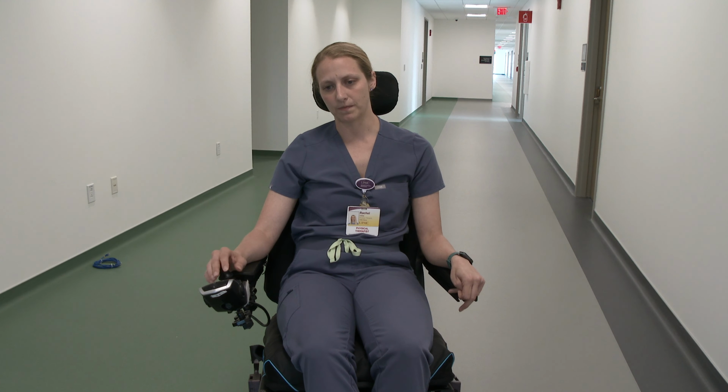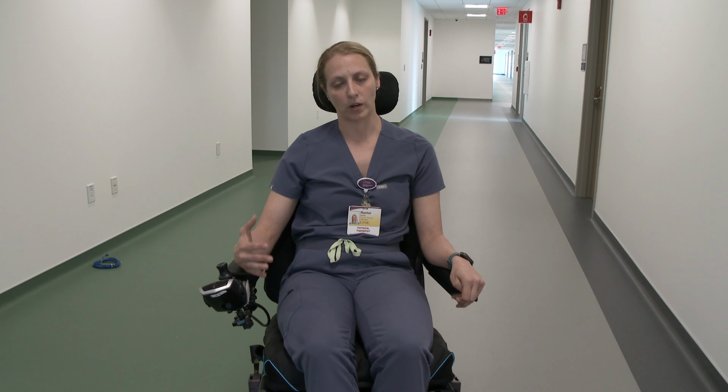And so knowing that while you're training somebody, that they may need a quieter environment, that they may not be as safe or independent in more complex situations, or that when they're more fatigued, they may even need someone else to use an attendant control or something else, given the large cognitive requirement to drive.